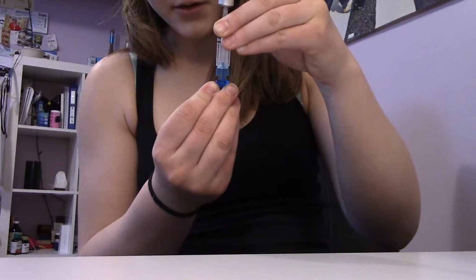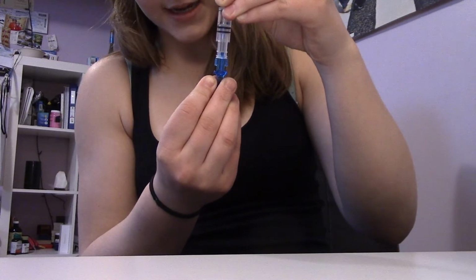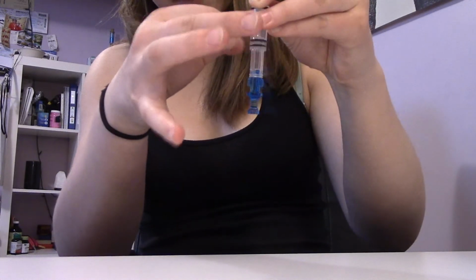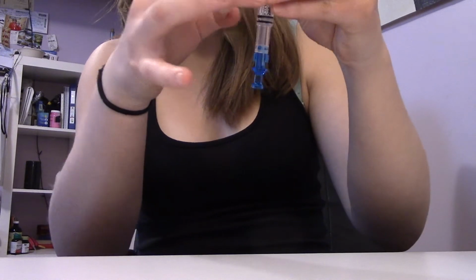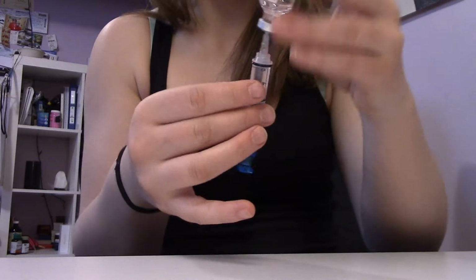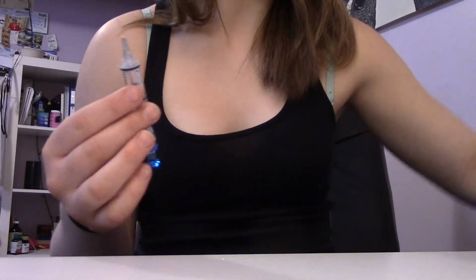Be careful you're getting rid of the air bubbles as you go down. I've never had a time where I haven't had an air bubble, so I just like to give it a couple flicks. Sometimes they're really stubborn, other days you don't really have much of a problem. So today wasn't too bad. So I'm just going to pull it out. We're done with this part for now.